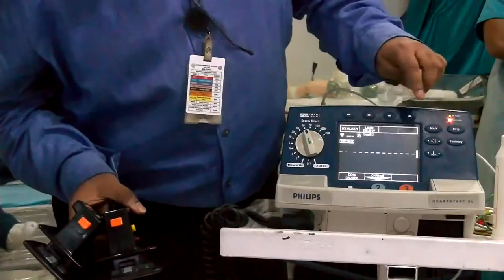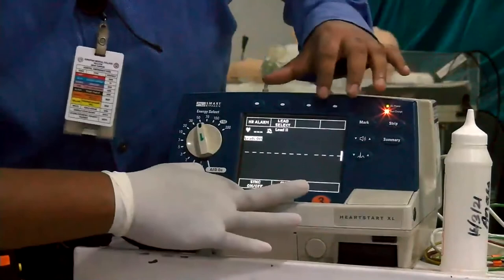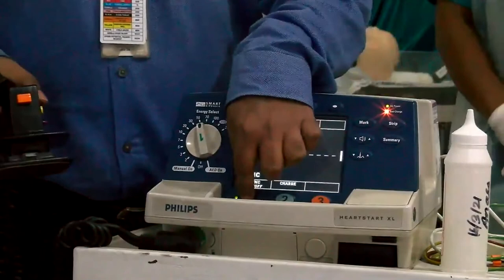But there is another important function, which is cardioversion. There is a sync button. Synchronize. Yeah, so there is a sync button here to press. Same steps, you may press to sync.